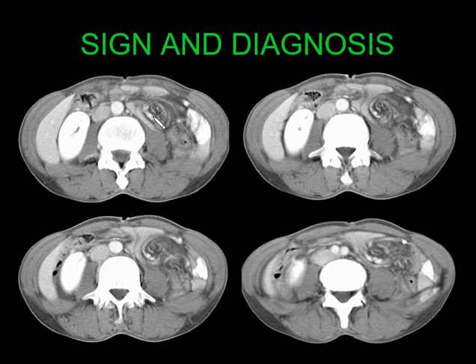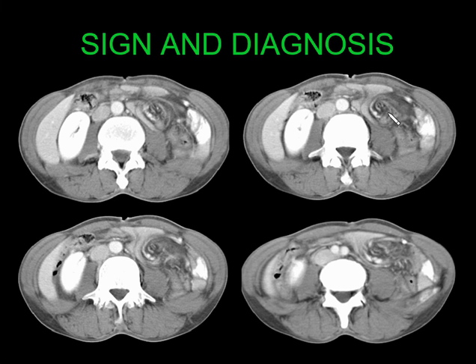Coming to the next case, you can see the classical whirlpool sign with twisting of the mesentery and vasculature along with small bowel dilatation. This is a classical case of midgut volvulus with the whirlpool sign due to twisting of mesentery or vessels, and it can be associated with malrotation.